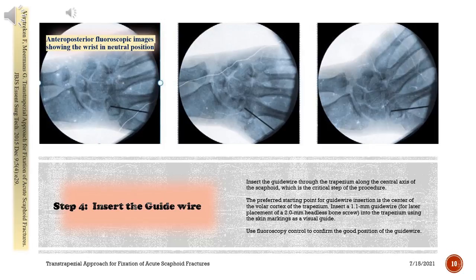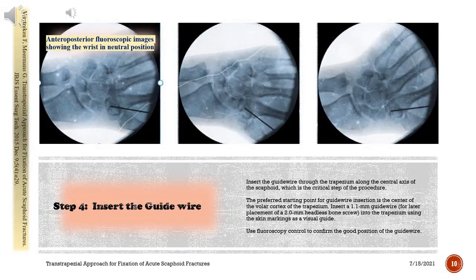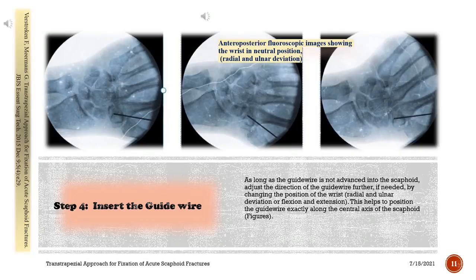Step 4: Insert the guide wire through the trapezium along the central axis of the scaphoid — this is the critical step of the procedure. The preferred starting point is the center of the volar cortex of the trapezium. Insert a 1.1 mm guide wire, for later placement of a 2.0 mm headless bone screw, into the trapezium using the skin markings as a visual guide. Use fluoroscopy to confirm good position. As long as the guide wire is not advanced into the scaphoid, adjust its direction by changing the position of the wrist — radial and ulnar deviation or flexion and extension — to position it exactly along the central axis of the scaphoid.